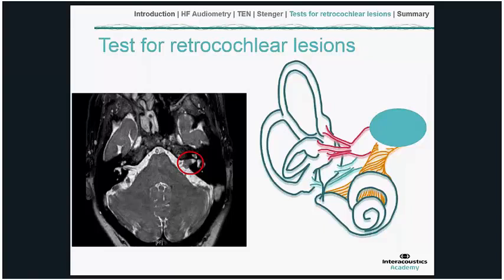A very common one will be, of course, the structural scan, the MRI scan, just like we're showing here, and that's highly sensitive to a space-occupying lesion. But there are groups of patients who can't have such a scan. For instance, patients who have some kind of metallic implant, perhaps they've had screws to mend broken limbs, perhaps they're claustrophobic and they can't tolerate being inside the scanner, or perhaps there are other reasons such as obesity, which means perhaps they can't actually fit in the scanner.